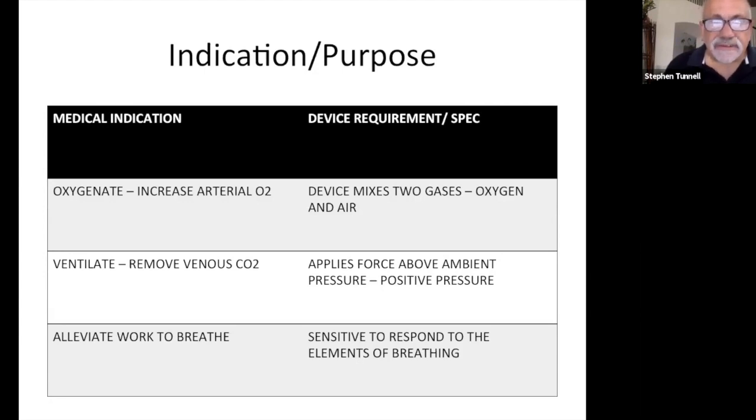When people present with a deficit, then we need to supplement their oxygen, and we generally initially will put them on a cannula or a mask, and we'll increase that oxygen concentration from room air, which is 21%, all the way up to, now with these smaller devices and these low flow devices, about 50% oxygen. So what is that? It's 50% oxygen and the rest is nitrogen. In the atmosphere, there's very little CO2. And of course, we add to it.